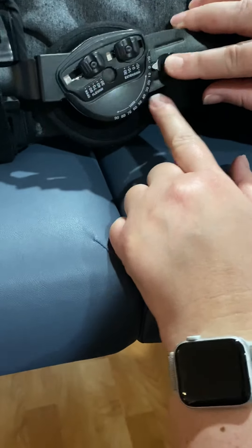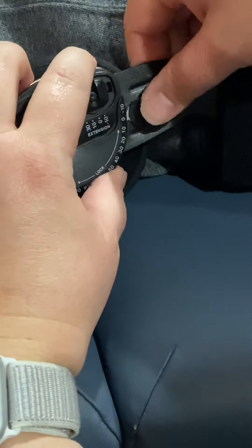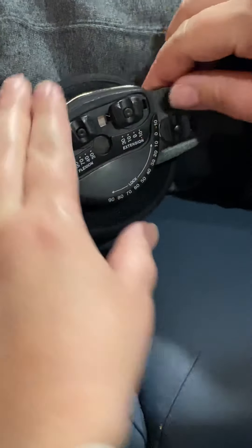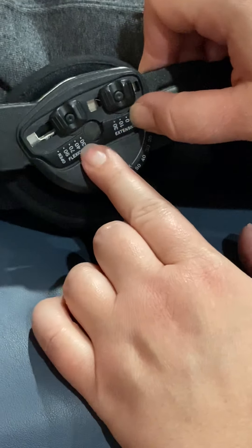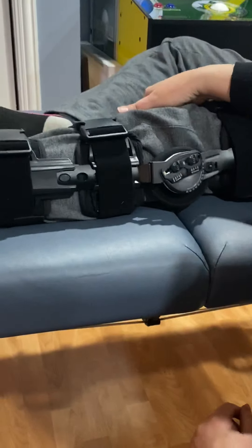This one's pretty easy. If I pull this little stopper out, now this will allow flexion of the knee. But if that's engaged, it doesn't matter what these settings are on — it's locked. Now once the doctor okays knee flexion, I would have to have these set where I want them. So right now this is set at zero degrees of extension, which is what we would want, and it's set at 30 degrees of flexion. I would just unhook both of these and now my patient can flex their knee. They're brand new, so we're going to have this all locked in.